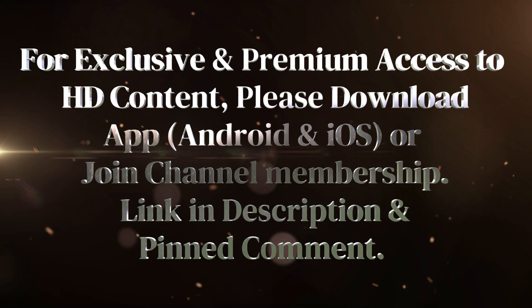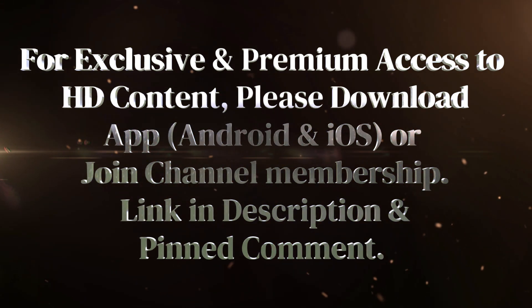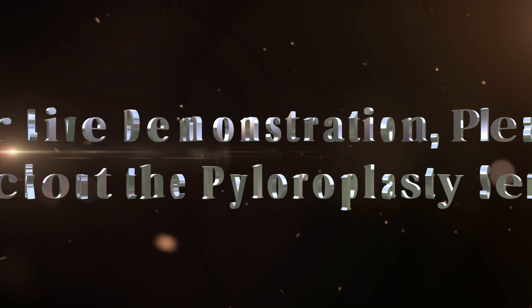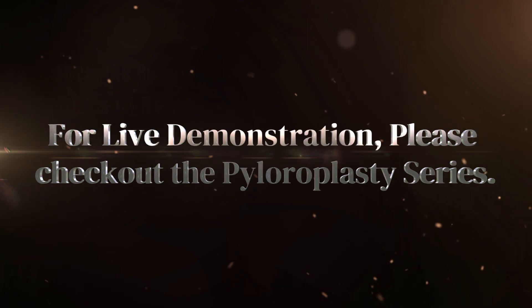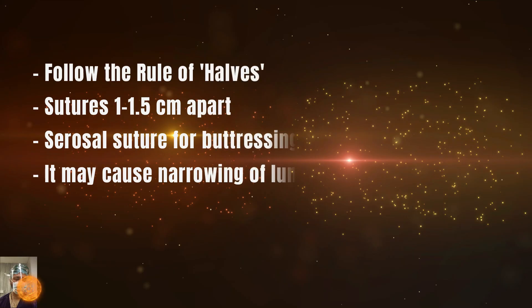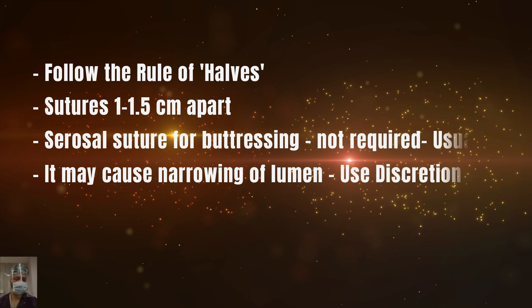Follow the rule of halves. Sutures are taken approximately 1 to 1.5 centimeters apart — keep around one centimeter. Do not apply another layer of serosa suture to buttress the Gambee stitch, otherwise it will lead to excessive inversion and may cause narrowing. If you have any concern, you may apply one or two stitches over the Gambee stitch, but not as a rule that you must cover the whole Gambee stitch layer. Use your discretion wisely.